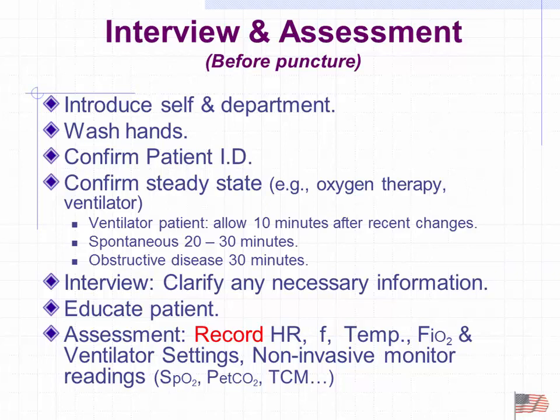If it's somebody who's spontaneously breathing, it's probably closer to 20 minutes to a half hour until they're in a steady state condition where the effects of that oxygen change can actually be evaluated. Might even go a little bit longer with somebody with COPD because we know their gas exchange is impaired.